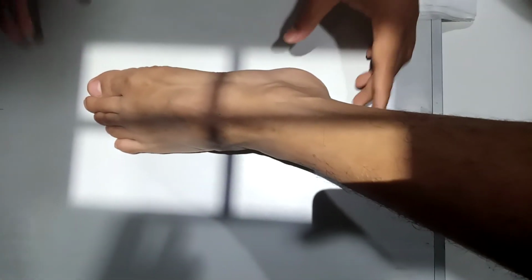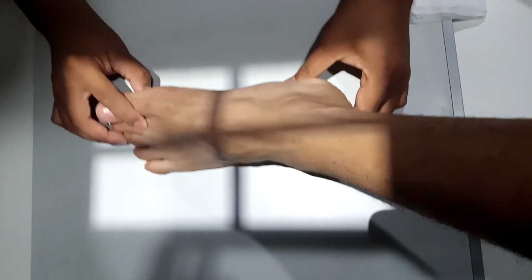Then, in collimation, remember to collimate on the four side margins of the foot, including the distal ankle. Note that in AP medial oblique, the third and fifth metatarsals must be free from superimposition, the cuboid must be clearly demonstrated, and the base of the fifth metatarsal must be seen in profile. And collimate at four sides. Perfect.